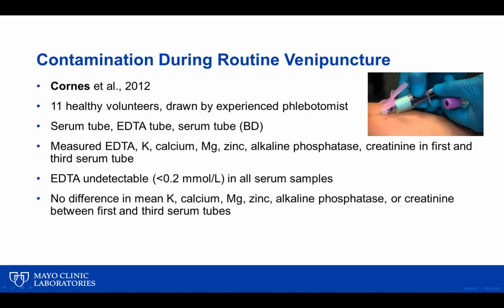So EDTA was not detectable in any of the serum samples when looking at the measurements that would be affected by potassium EDTA contamination. Obviously, there was no excess potassium detected. And then the metals like calcium, magnesium, and zinc, where we would expect those to chelate to EDTA and be falsely reduced, and also the enzyme like alkaline phosphatase that needs calcium and magnesium for those reactions, were also not reduced.